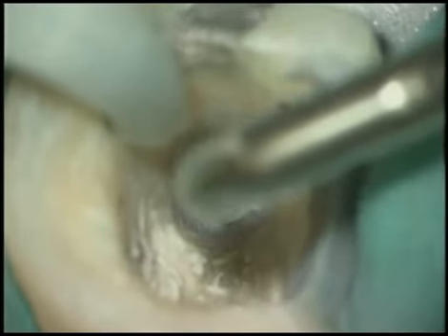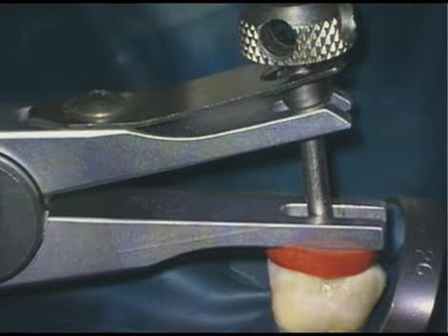It is axiomatic that cement will lie apical to the post. Eliminate it with ultrasonics. Now refer to another tape in the Retreatment series on gutta percha removal. In this show, we have seen the PRS in action several times.